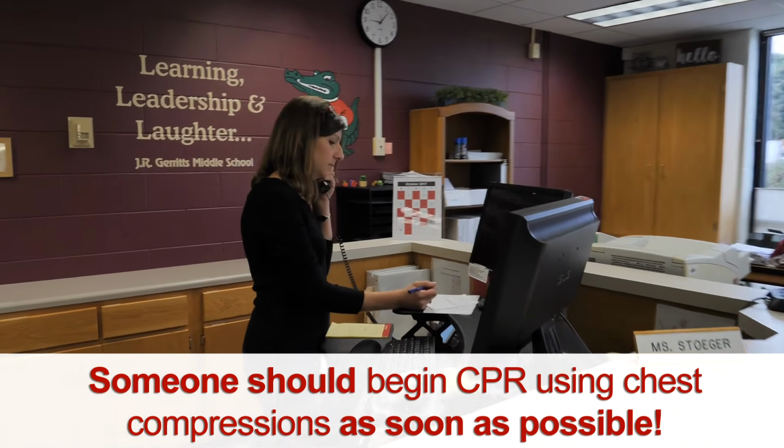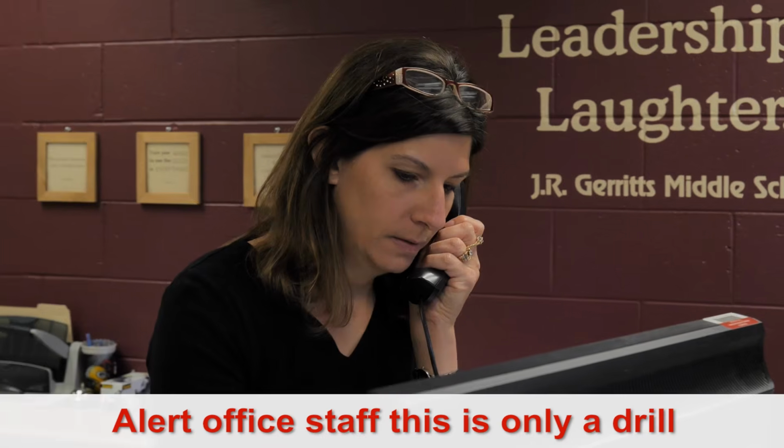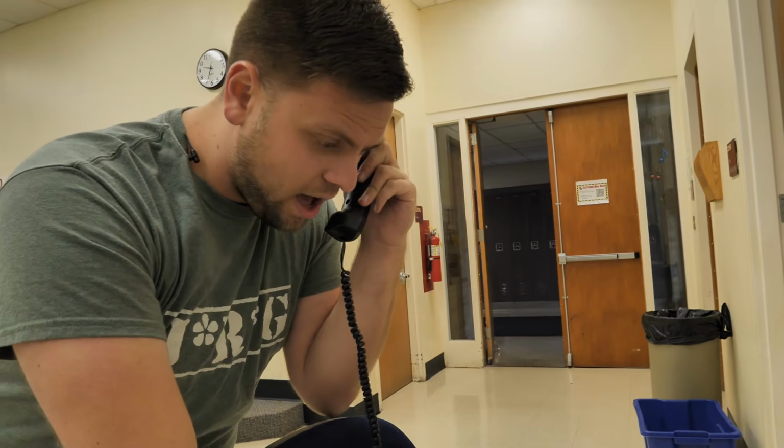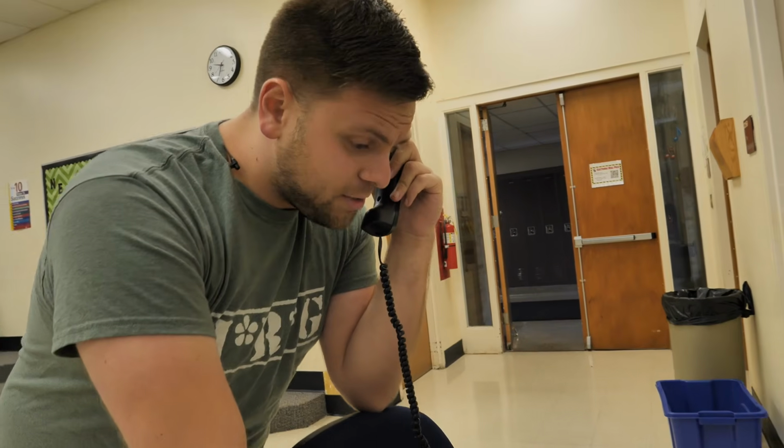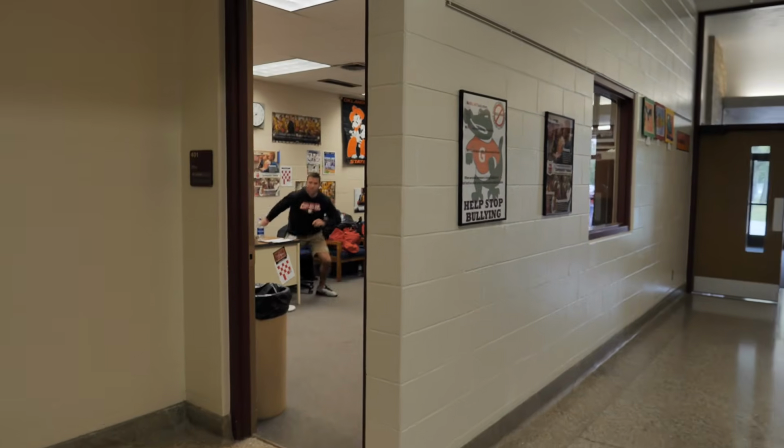This is the office. Hello, this is Mr. Lee in the choir room, and I'm going to need the E-team. And what is the student's name? The student's name is Annie Smith. And their grade? She's a 7th grader. And what is the problem? She is unconscious. I'm not sure if she's breathing. All right, we'll send help. E-team to the choir, room 325. E-team to the choir, room 325.